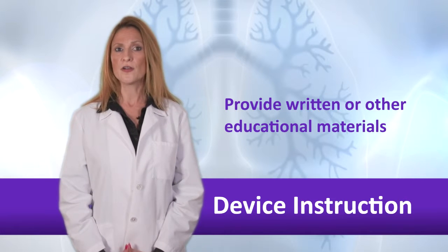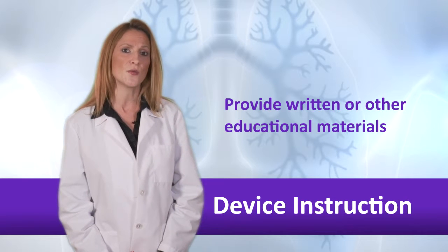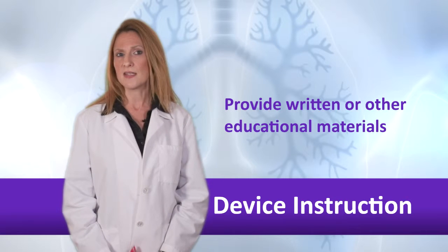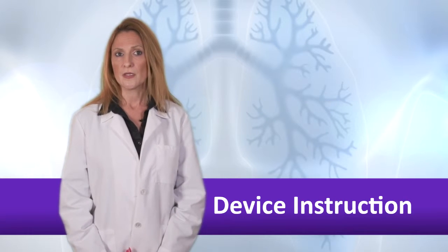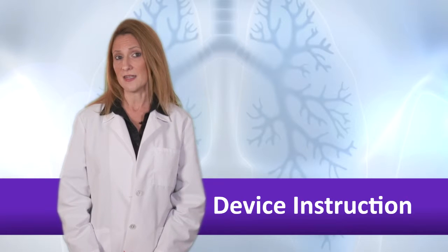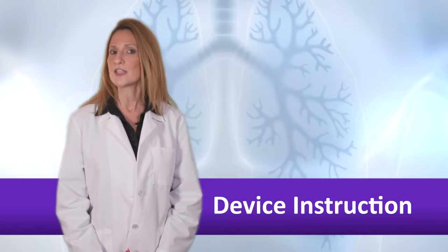Provide written or other educational materials. After adequate practice, provide the patient with a written technique tip sheet for the patient to take home. Correct technique requires multiple steps, up to 10 to 15 steps depending on the device. So a written reminder is useful. Written instructions alone have not been shown to be effective in teaching technique, but adding written instructions to verbal instruction has been shown to improve retention.